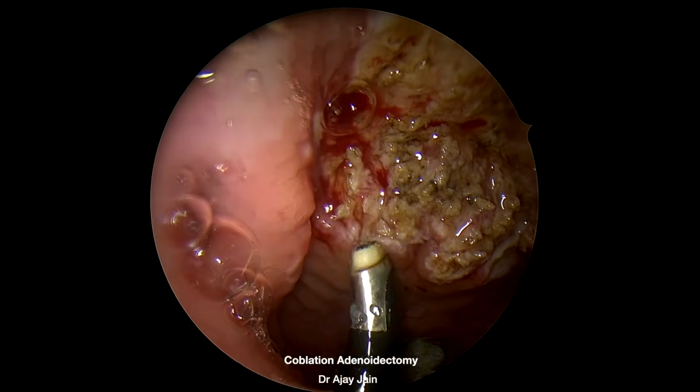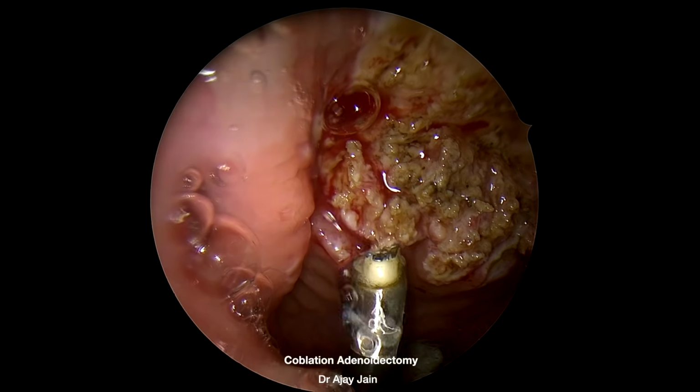I am able to stop, and this side adenoid also is at the same level.